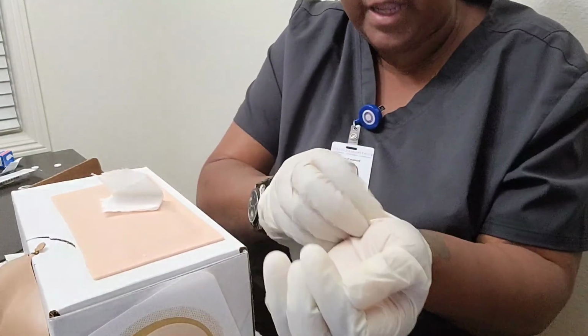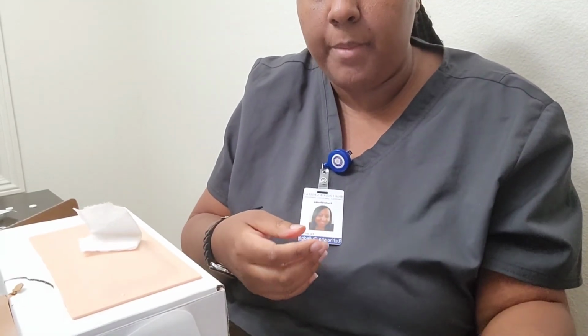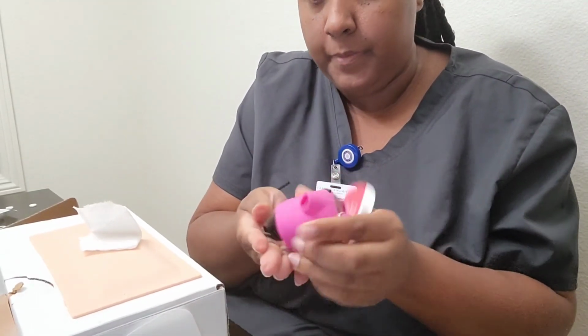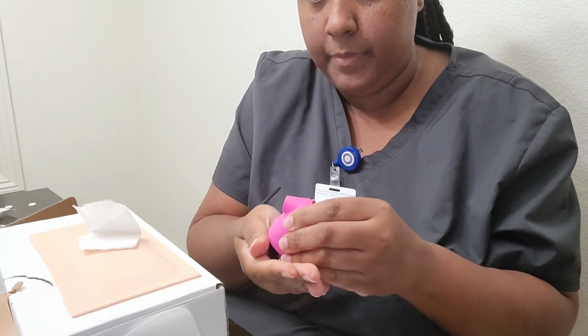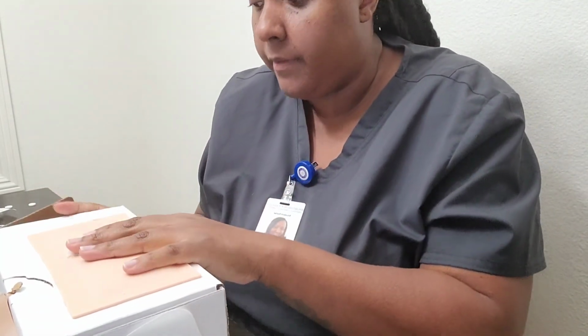And I'm going to go ahead and remove my gloves and perform hand hygiene. And then I will go ahead and I will document this procedure. And I will leave the patient in a comfortable position. If everything is okay, make sure they have a call light, and then document this procedure. And that is it for this video.